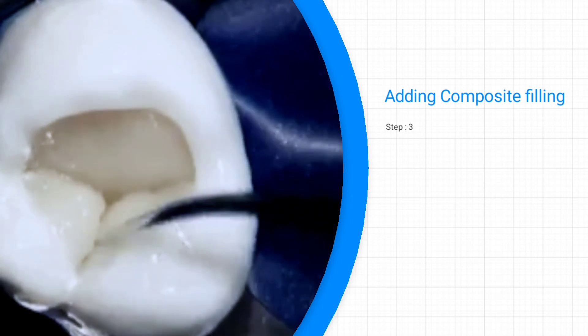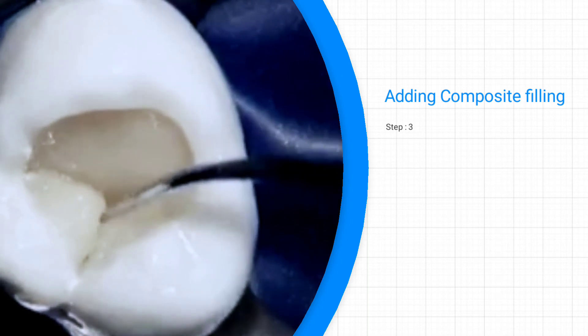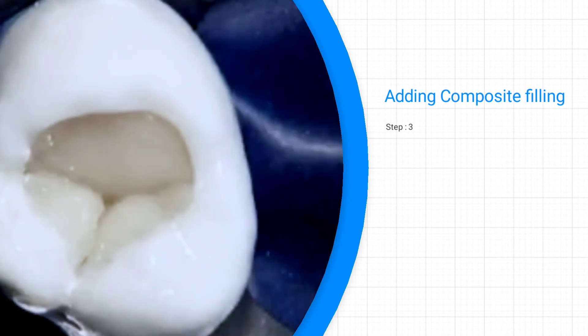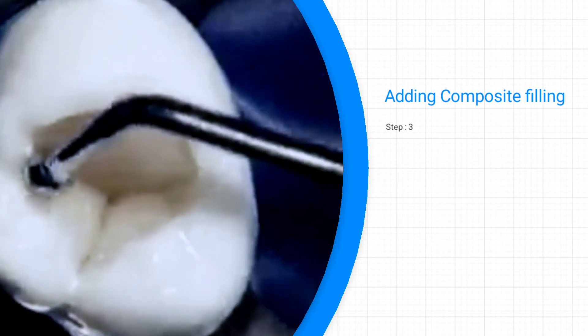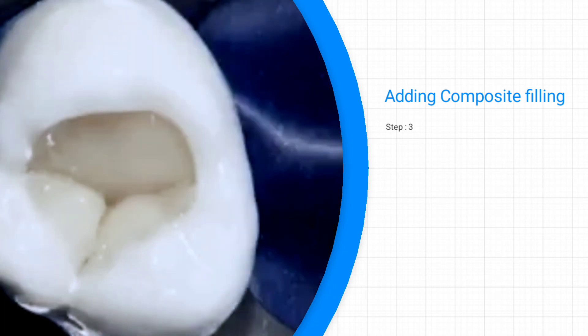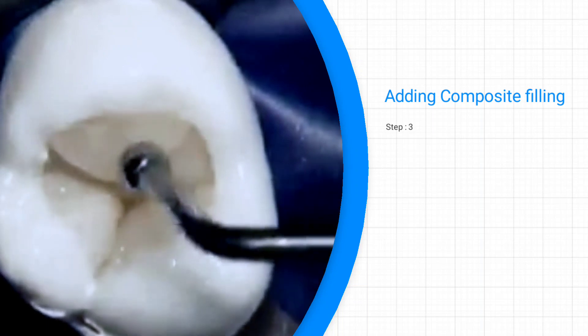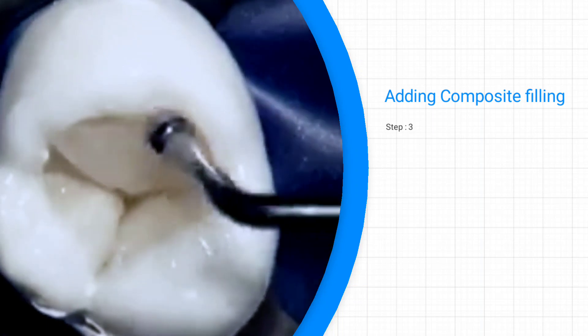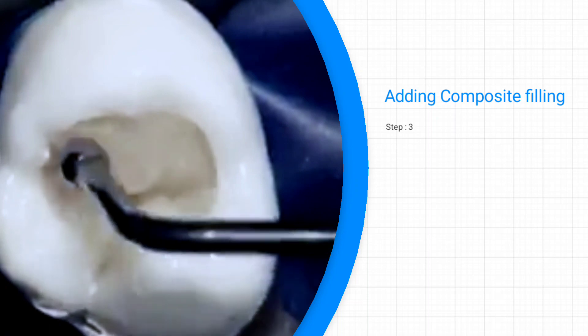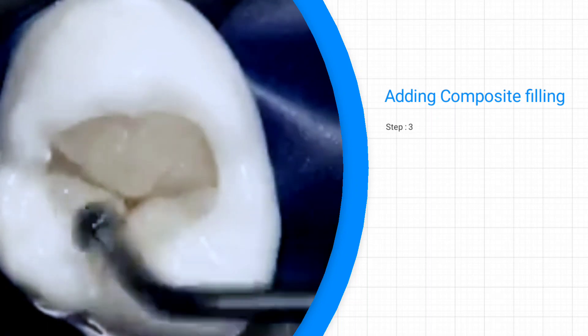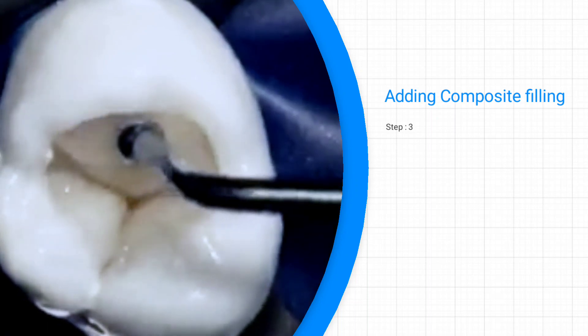Since moisture control is so important during this step, you need to make sure that the patient stays with a wide open mouth so that the tooth remains dry during the whole process. That's the reason we use rubber dam, and rubber dam is so important for a composite restoration.